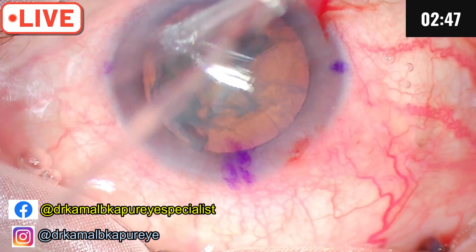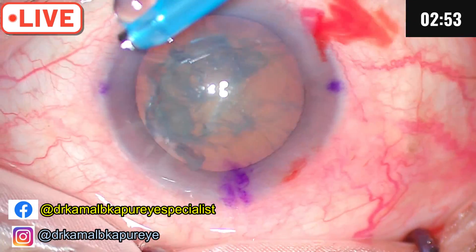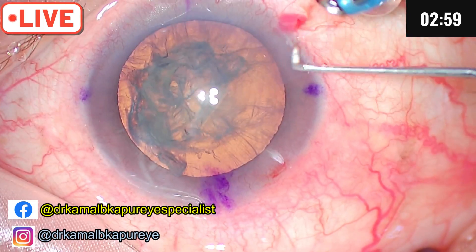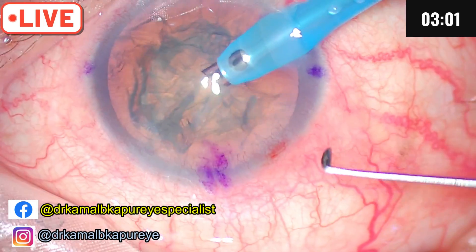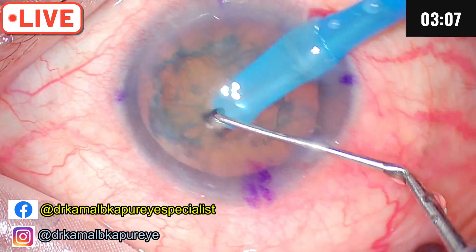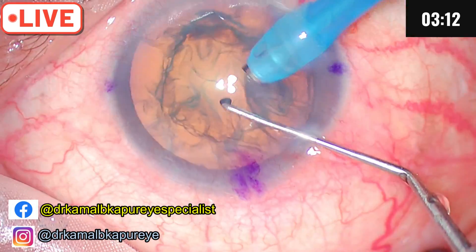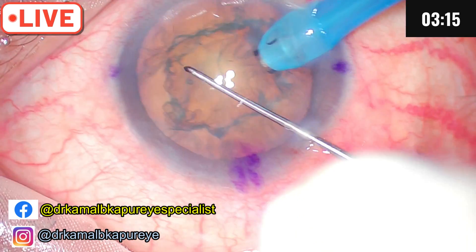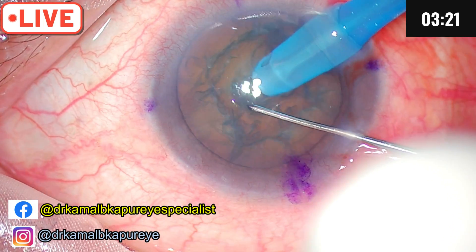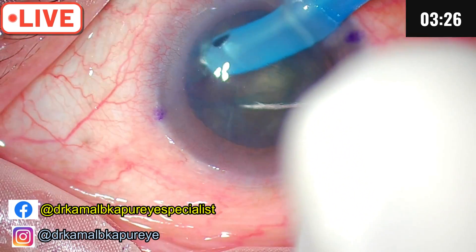Since this is a soft cataract, I will use less tip exposure. In order to avoid Descemet's detachment, it's a good idea to lift the corneal wound. As described in my previous sessions, in soft cataracts it is a good idea to shave off the floating cortical plate or the upper nuclear plate so that you have a clear view of the nucleus. We use very low phaco here to divide the cataract.